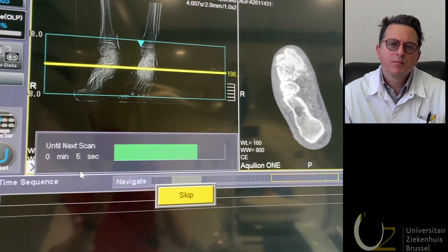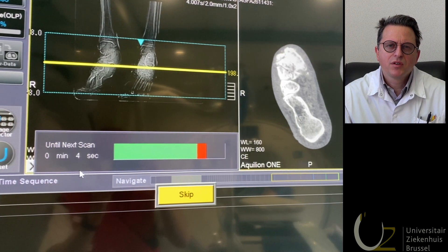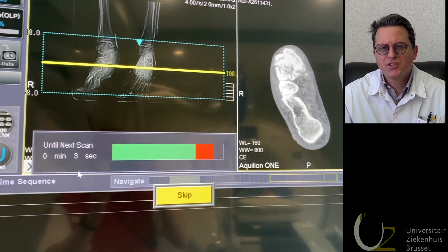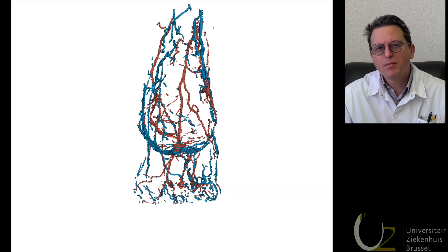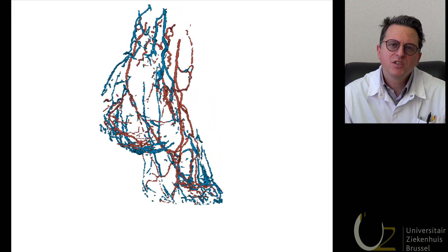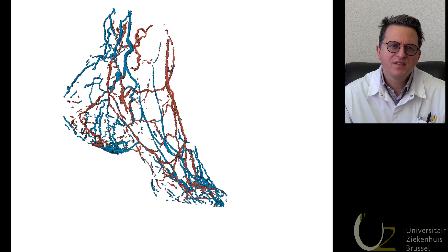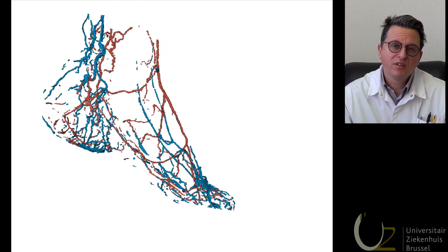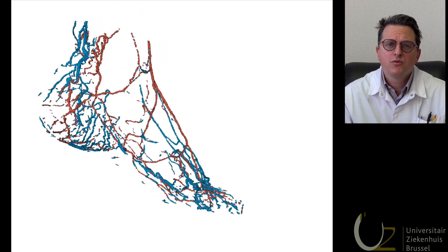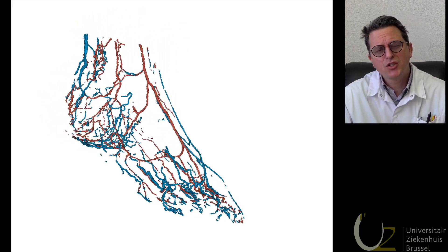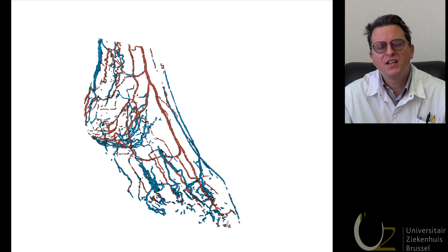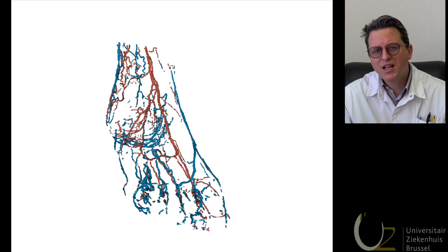As an example, time-resolved CT angio scanning is perfectly capable of distinguishing between arteries and veins, because the former receives contrast in a much earlier phase than the latter.